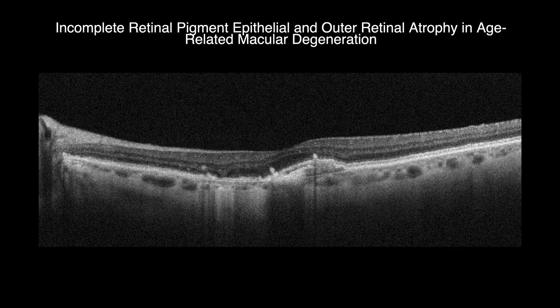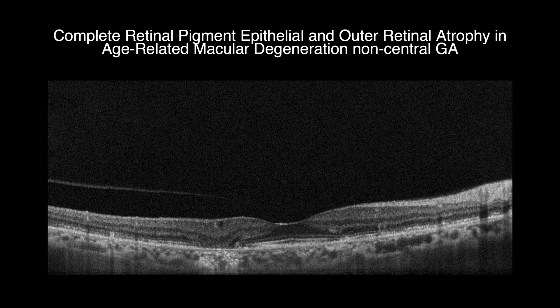RPE can be atrophied completely or incompletely. In cases of incomplete retinal pigment epithelial and outer retinal atrophy in age-related macular degeneration, the RPE is not completely atrophied. It will be presented with increased reflectivity of the underlying choroid with attenuation or disturbance of the RPE layer, with or without outer retinal atrophy including ellipsoid zone degeneration. In contrast, when RPE is completely atrophied, it will show loss of the RPE layer. Only Bruch's membrane is visible with increased reflectivity of the choroid due to the absence of RPE to reflect light, and it will be associated with the loss of the ellipsoid zone and external limiting membrane.